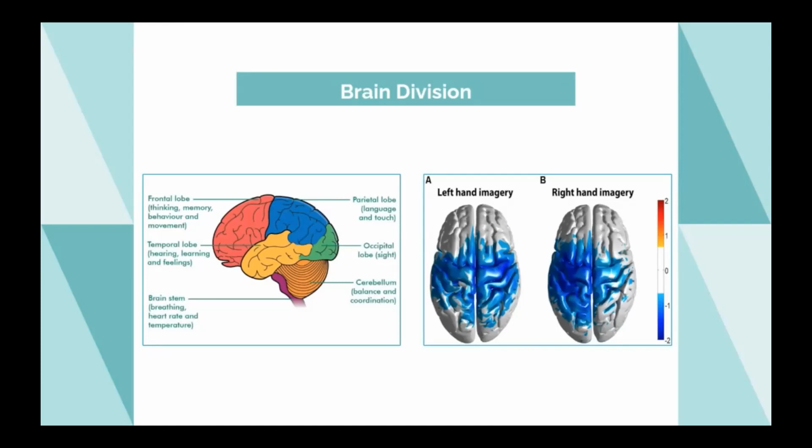We realized that our models were always overfitting because we used all the electrodes from the signal, which contained signals from different parts of the brain that did not contribute to the classification task at hand, which was classifying activities related to motor imagery or movements. Therefore, we decided to only use the electrodes that contain the signals related to motor movements or imagery. This is how we were introduced to the process of scouting.